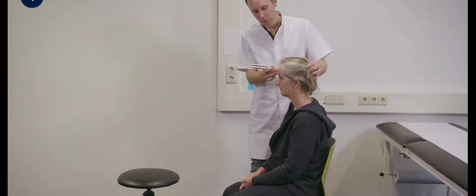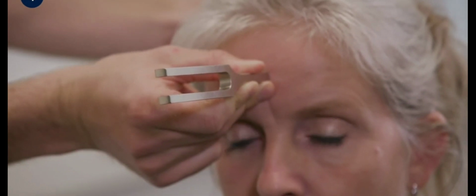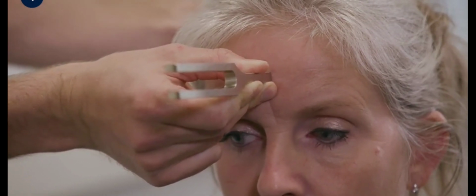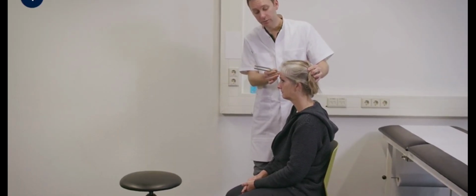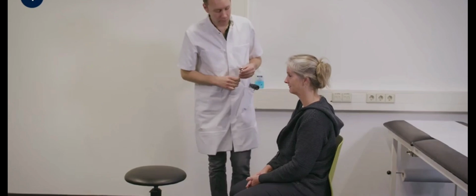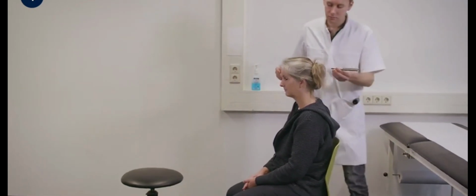To perform Weber's test, the examiner places a vibrating 512 Hz tuning fork in the midline of the patient's forehead. The patient is then asked on which side they perceive the sound to be loudest. If Weber's test localizes to the better hearing ear, this implies a sensory neural hearing loss, whereas if it localizes to the poorer hearing ear, this implies a conductive hearing loss.